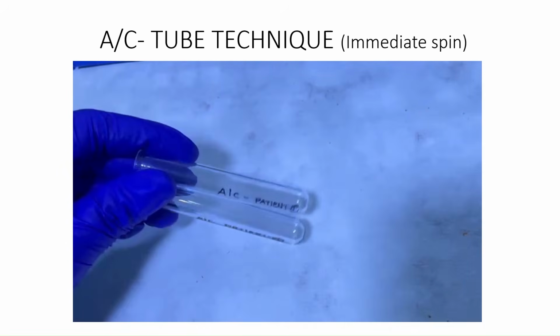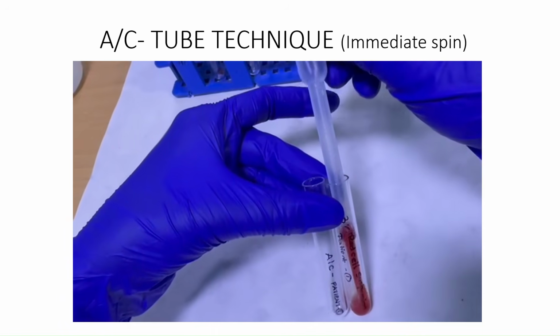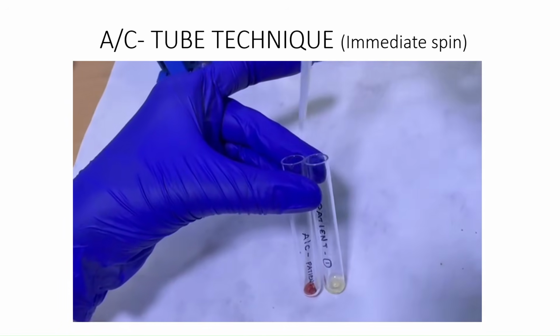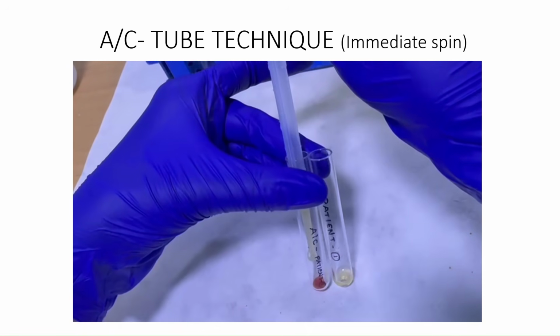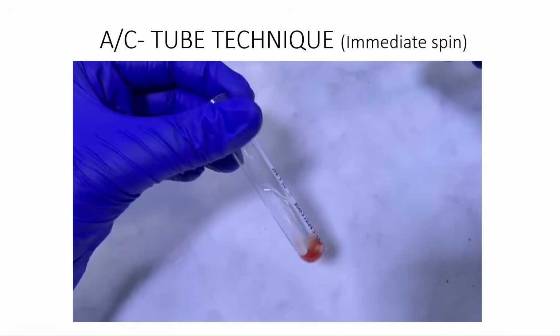Now we are going to perform autocontrol using tube technique. For that we have taken two separate clean test tubes for patient 1 and patient 2. Add 1 drop of 3% red cell suspension into the clean labeled test tube and 2 drops of patient serum. So first we have added 1 drop of 3% red cell suspension and 2 drops of patient serum. Gently mix the contents.